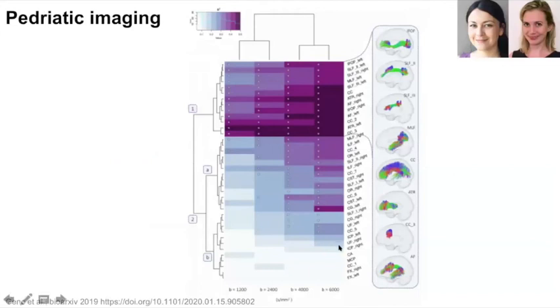Then Sila Gensch and Erica Raven really spearheaded pediatric imaging on the connectome scanner. We scanned a lot of kids between 8 and 18 years old with an advanced diffusion imaging protocol. And we spent quite a bit of time trying to optimize the pre-processing for this challenging group to scan, because obviously they move more than adults.